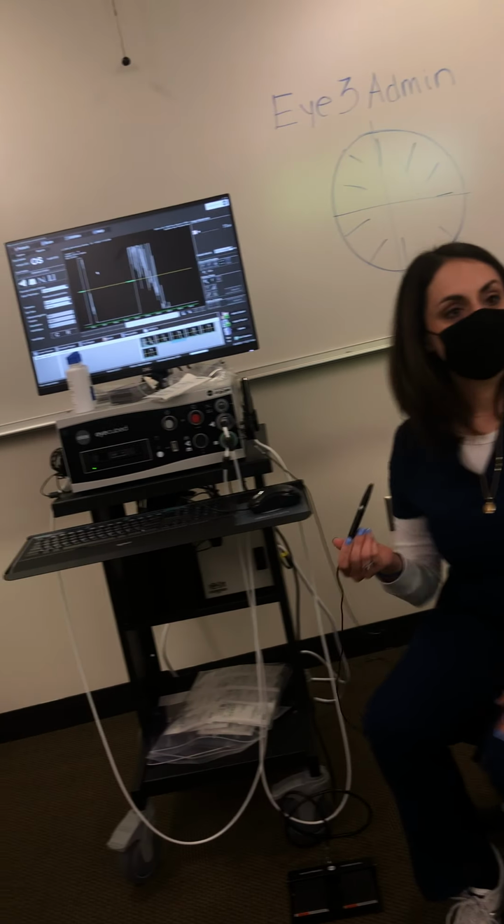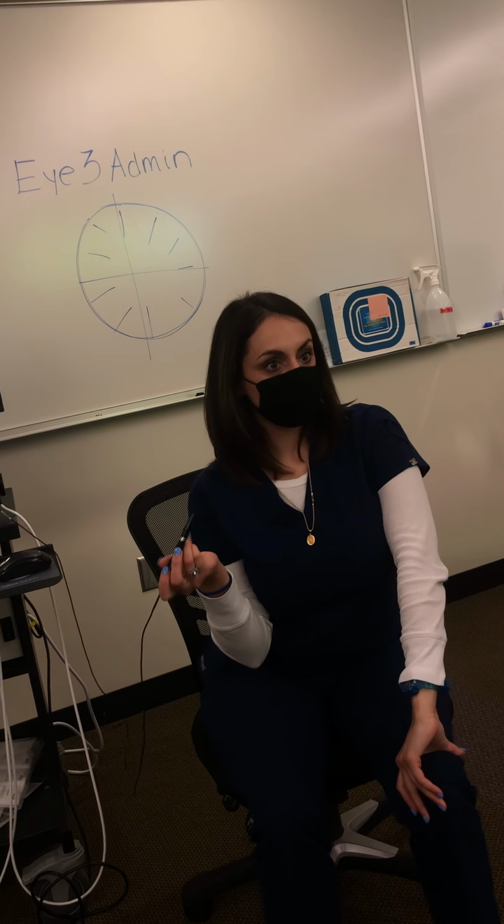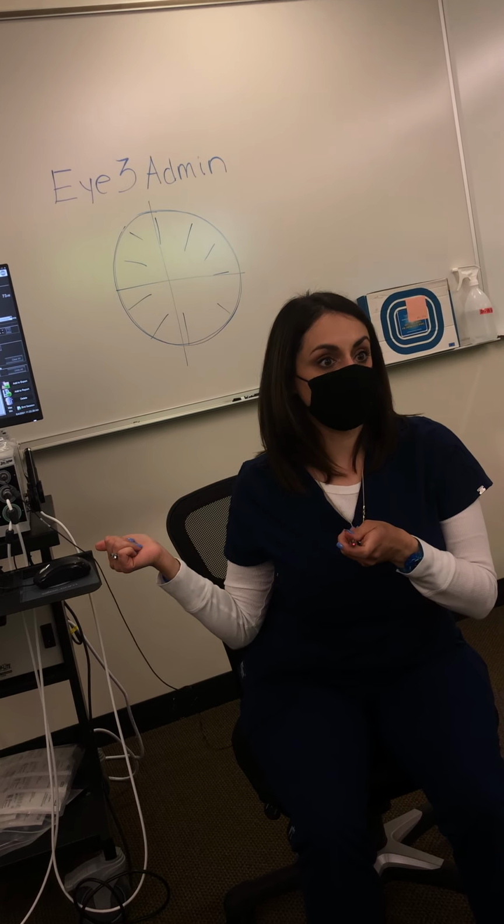So what goes on the eye? Proparacaine, then gel? And then you don't need any gel. Okay. They used to use these with just gel, you know.